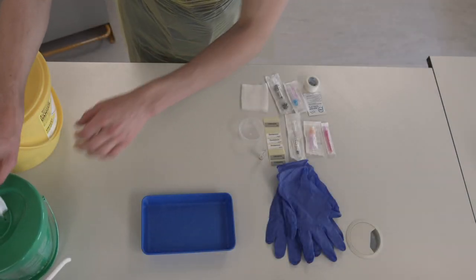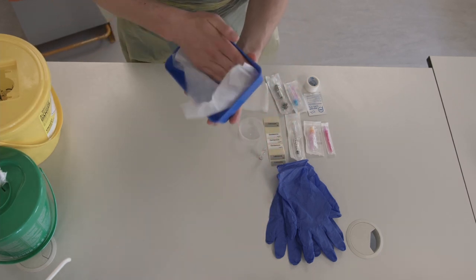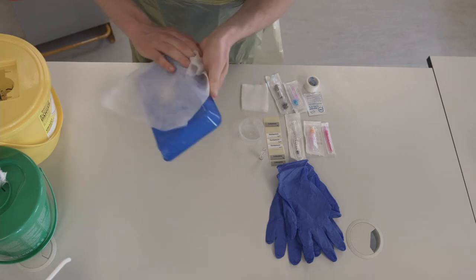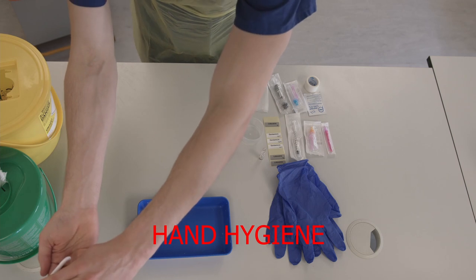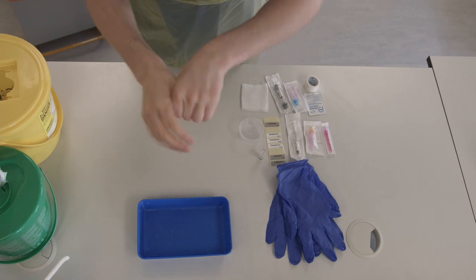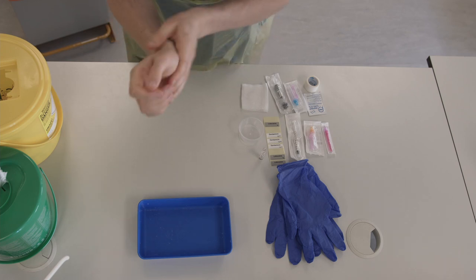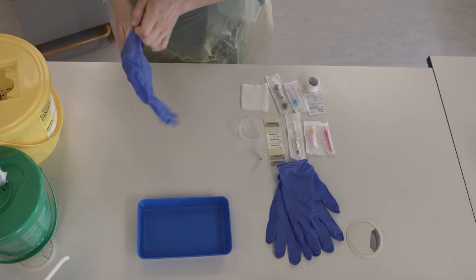This video will show you how to prepare and take an ABG sample. To start, wipe your tray with a Clinell wipe. Then wash your hands using the 7 steps of hand hygiene. Put on a pair of non-sterile gloves.